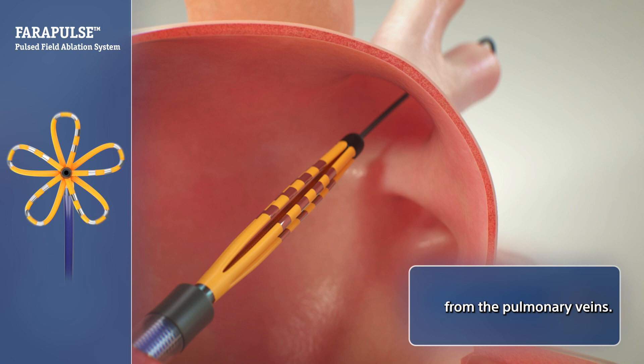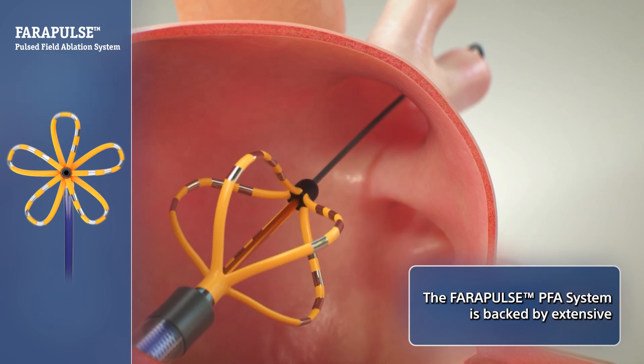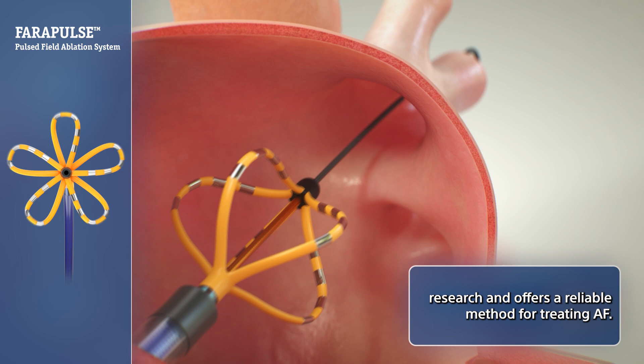from the pulmonary veins. The Ferrapulse PFA system is backed by extensive research and offers a reliable method for treating AF.